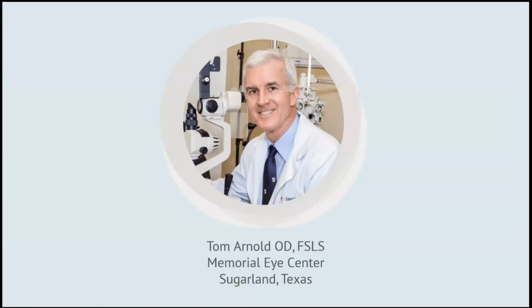Yeah, thank you. Well, thank you. I'm very honored. I'm very flattered. I've known most of you for a number of years now. It's been really exciting to see the development and the improvement in scleral profilometry.